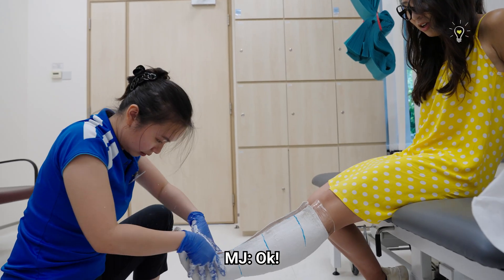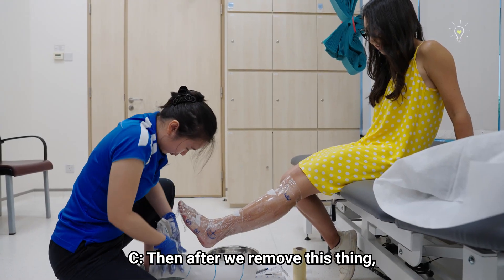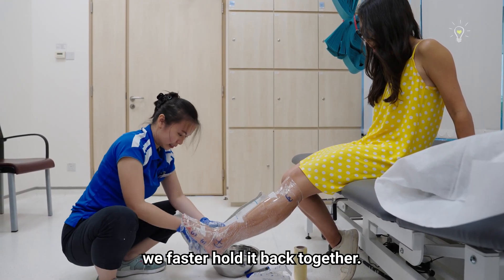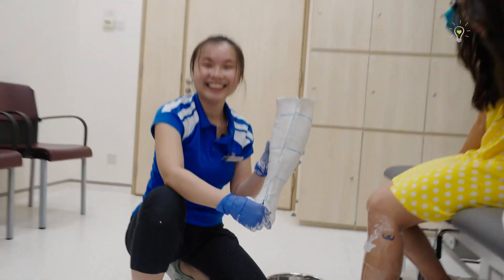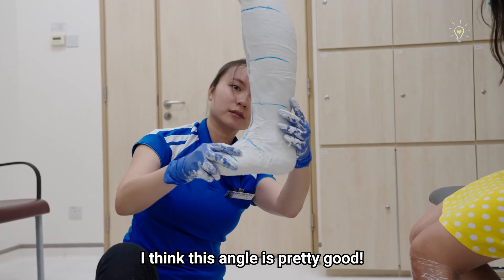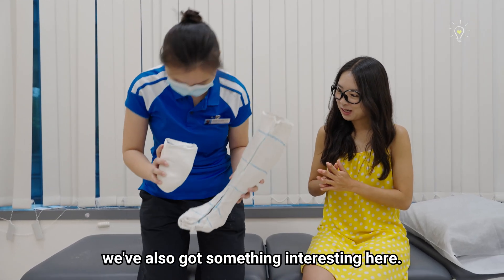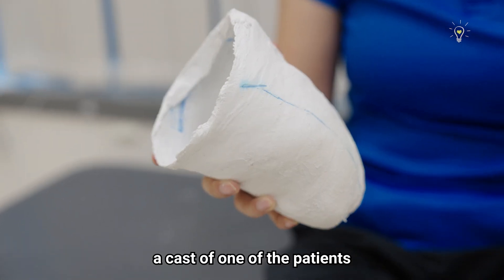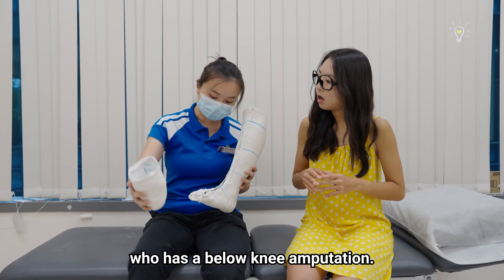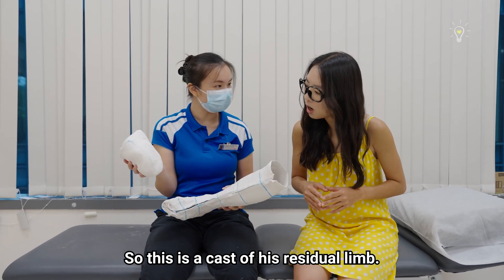Okay, hold your foot there. After we remove this and hold it back together — this is the cast of the leg. The angle's pretty good. We've also got something interesting here: this is actually a cast of one of our patients who has a below-knee amputation. So this is a cast of his residual limb.